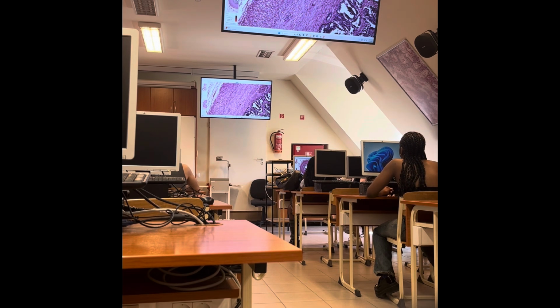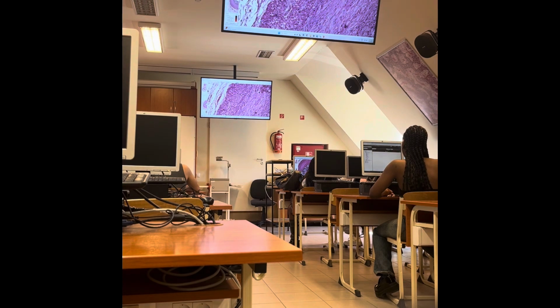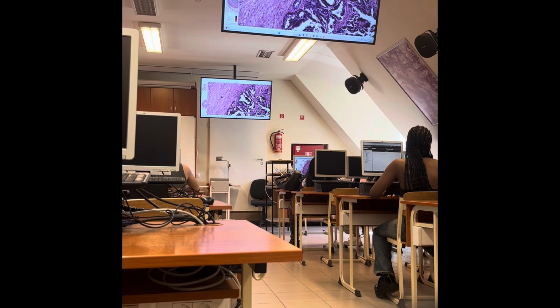What do you think, how many layers are visible here? There are only 2 layers. So instead of the 3 layers in the previous segment, in the spermatic cord, we now see just 2 sublayers of the muscle. What is the orientation of this inner one? In this case it's circular for the inner layer and longitudinal for the outer layer. And the inner longitudinal layer is missing.